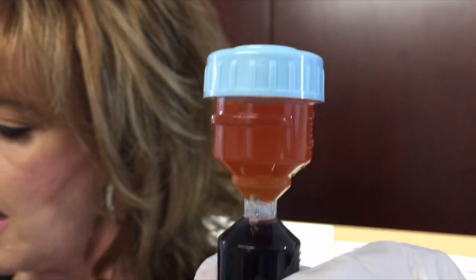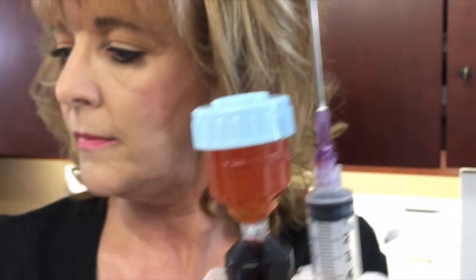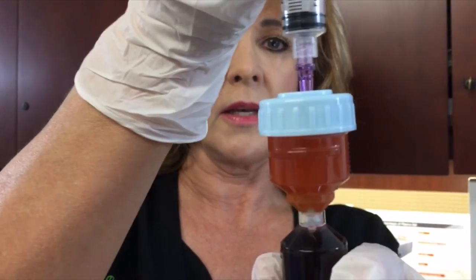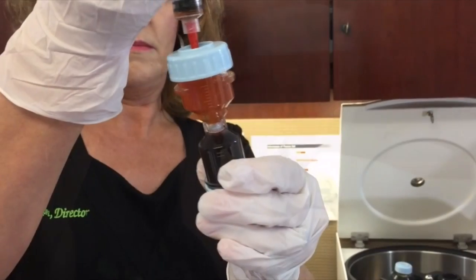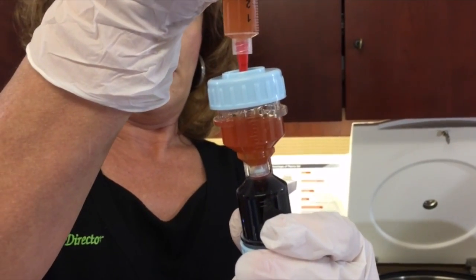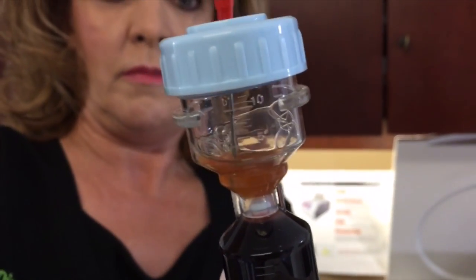You've got a few red blood cells in there but that's a perfectly good sample. Then you can take a 10cc syringe, remove the top cap — we also refer to that as the lid — insert your needle. There's still an additional bladder in there that keeps it sterile. You can begin to withdraw. This is my blood — it's separated beautifully. I did give a little bit more than 10cc's of final volume, which you'll get occasionally from patient to patient.